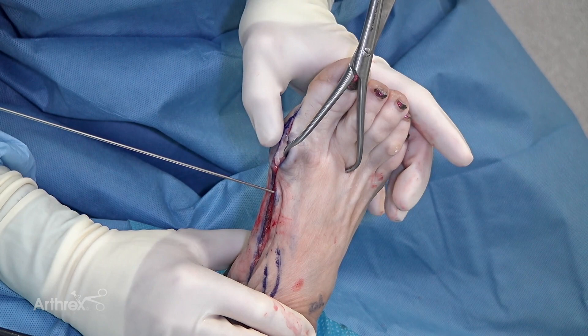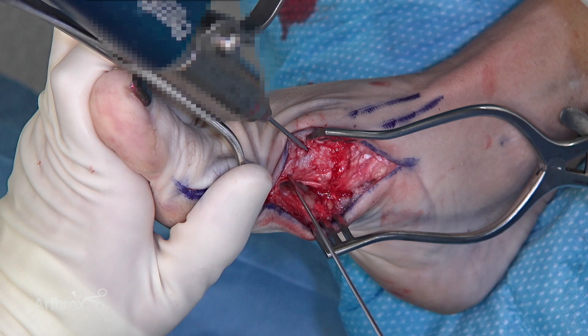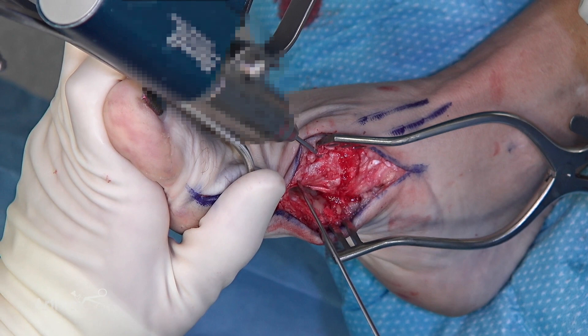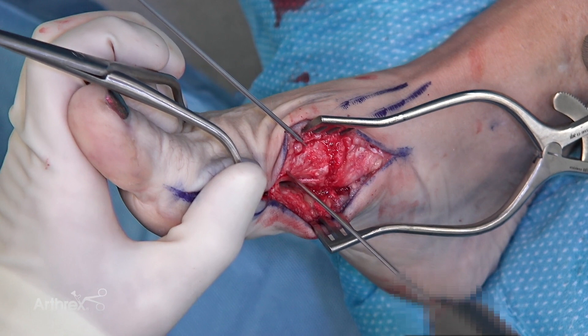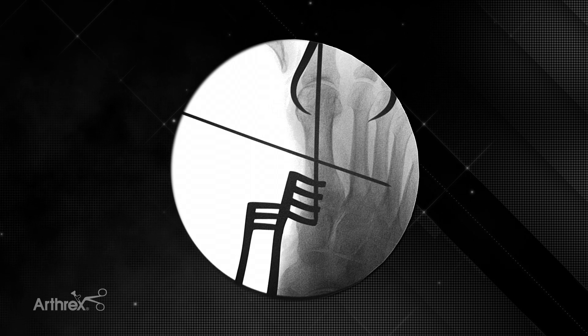I would caution you on taking the bump off — that softens the bone, so I like to leave the cortical bone as I do the reduction. If you're going to take the bump off, do it at the end after this. So now I'm going to compress the joint manually. Eliciting the windlass mechanism helps to hold the metatarsal in the right position in good alignment with the lesser metatarsals. I'll usually take the joystick K-wire and try to position it angled towards the second metatarsal, and I can throw this into the second metatarsal for additional stability while we fixate.